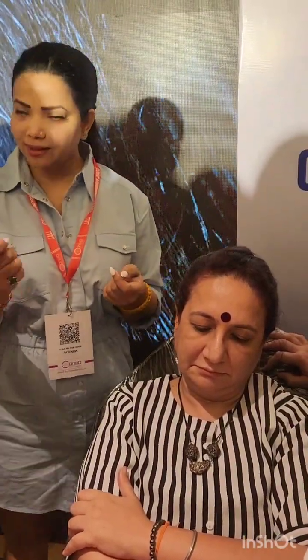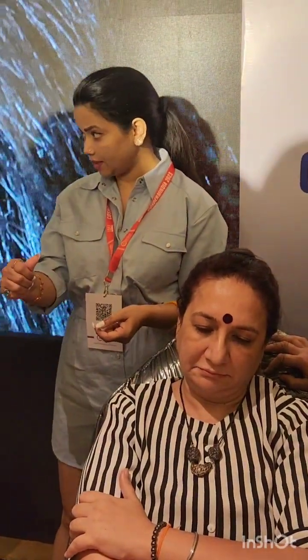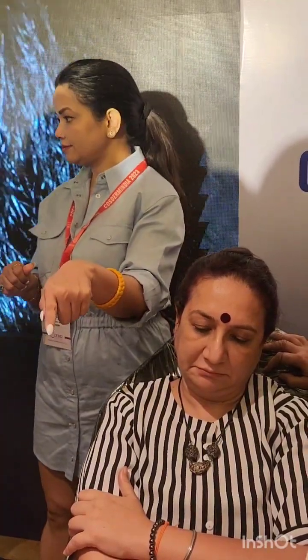Again, don't panic. Just pull back. Again, advance a little more superficial than that. You can just put your finger behind over the needle and the thread, so that the thread should not slip through. Okay. And then pull back and again, a little superficial to that.